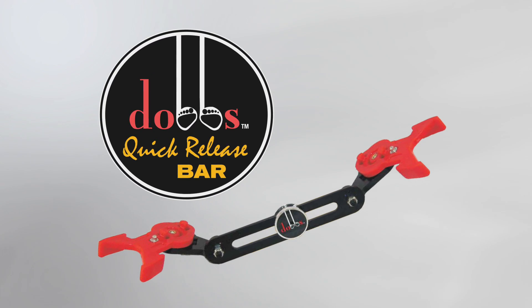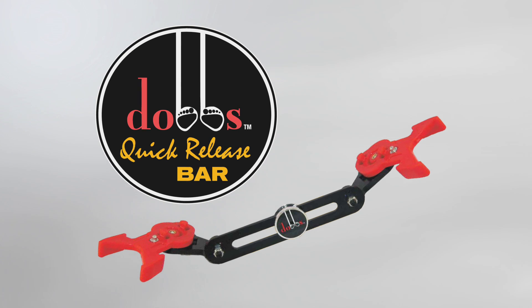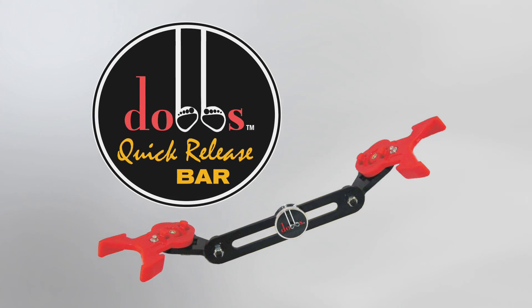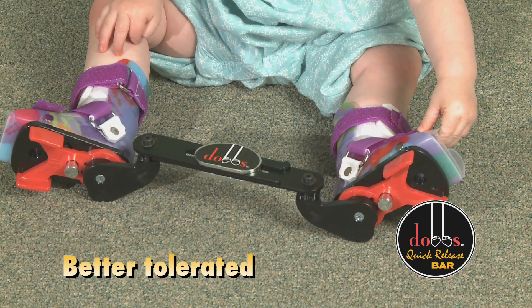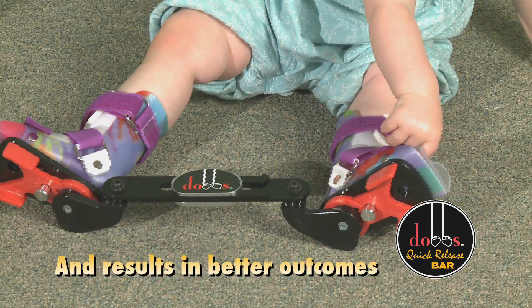Introducing the Dobbs Bar — a new device that transforms an old idea into a more clinically efficient choice to maintain correction after casting and prevent relapse. Created by Dr. Matthew Dobbs, the Dobbs Bar allows more freedom and relief for children and their parents.